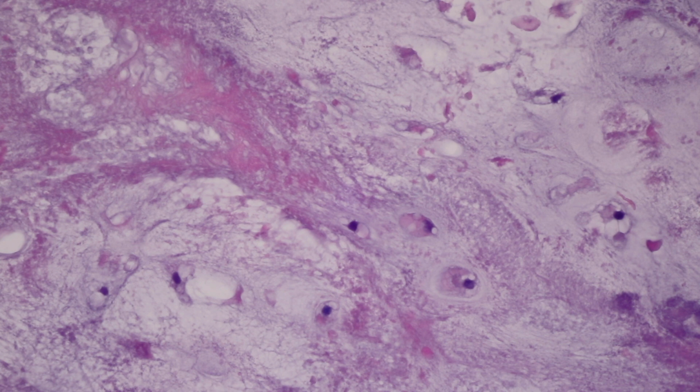Do I ever make a diagnosis of chondrosarcoma in the absence of infiltration? And the answer is yes. And all I can use is subjective terms. When there is moderate to severe cytologic atypia, moderate to high cellularity, where I feel it has crossed the line that no enchondroma would, whether it's arising in the digit, and I mention the digit because enchondromas in the digits are often hypercellular and show mild cytologic atypia. When I feel it's crossed that line with regards to the degrees of cytologic atypia and cellularity.